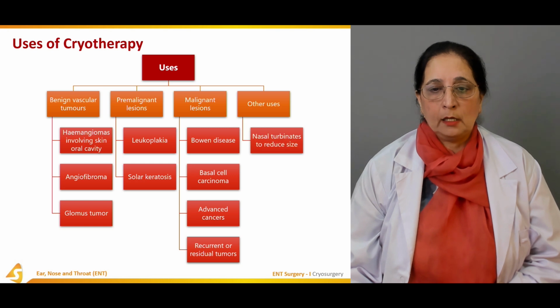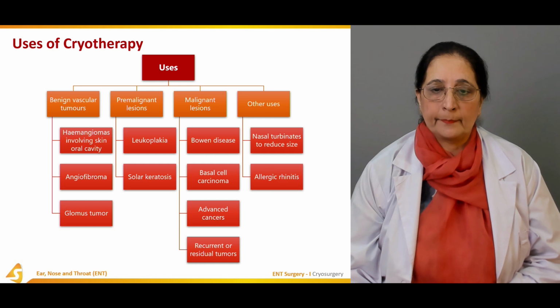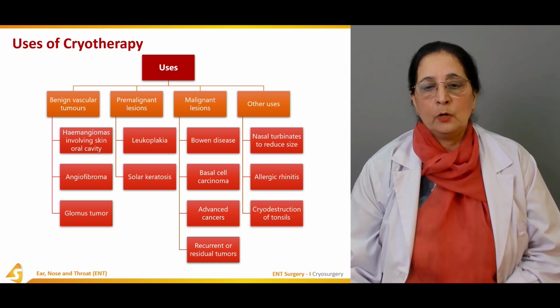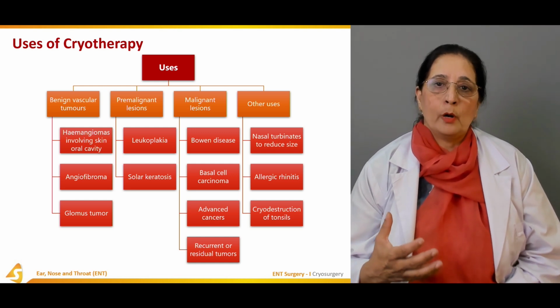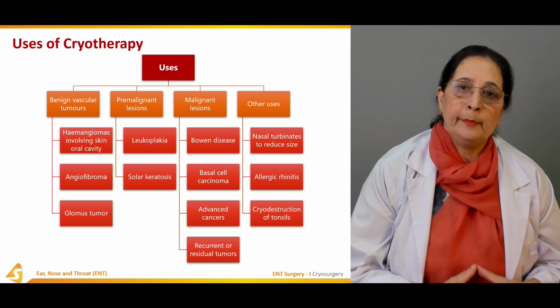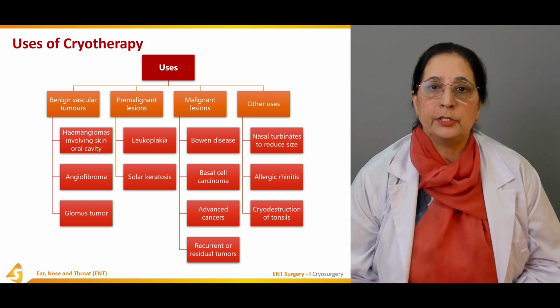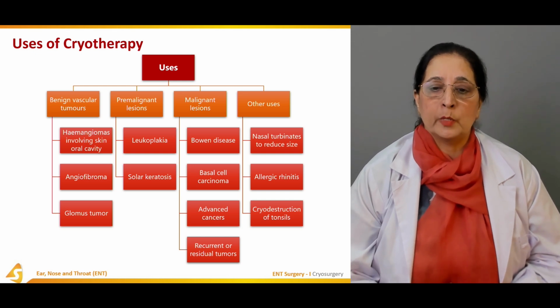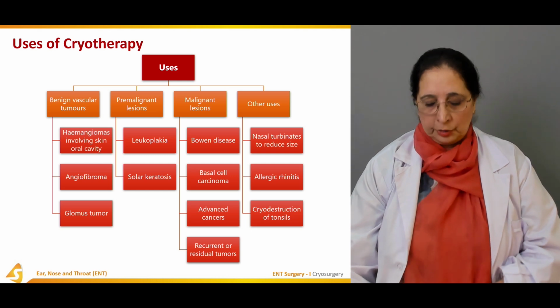Other uses are nasal turbinates to reduce their size, allergic rhinitis, and cryodestruction of tonsils. These are some very common uses of cryosurgery. In all these conditions, we can use cryosurgery.